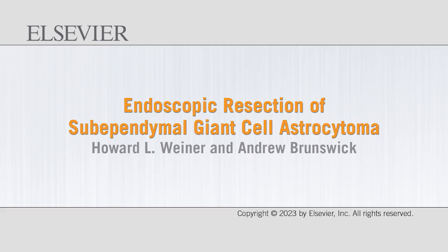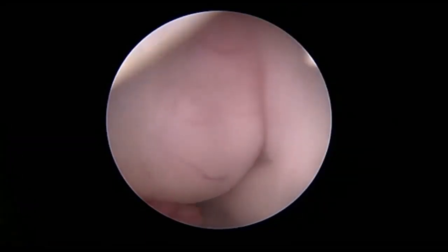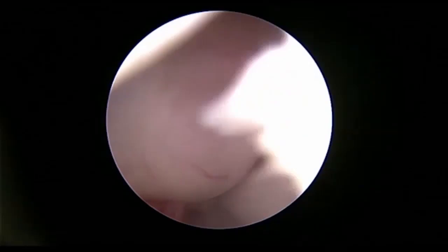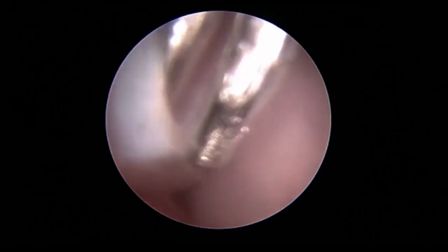This patient is a young boy who underwent endoscopic resection of a right-sided growing subependymal giant cell astrocytoma. This is the initial view of the tumor in the right lateral ventricle. We are coagulating with the endoscopic bipolar the surface of the tumor. You can see the choroid plexus deep to the tumor.